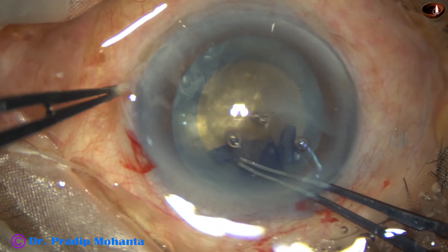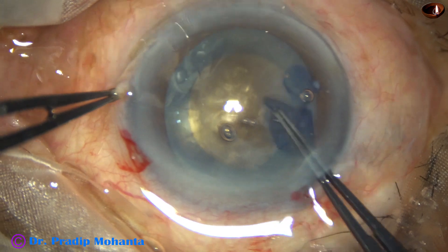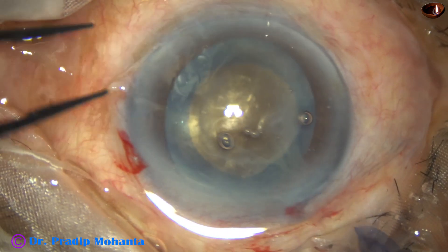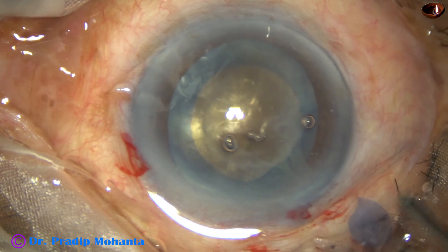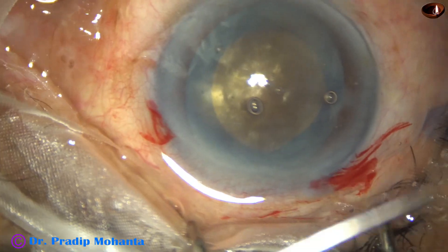Not only hard, it is a mobile nucleus — a free-floating nucleus. So it is going to be tough to manage this nucleus.